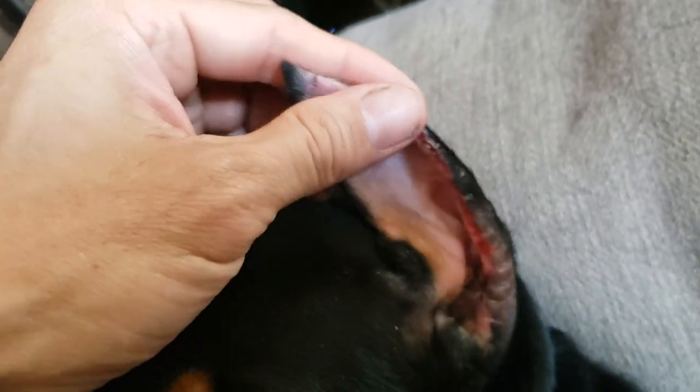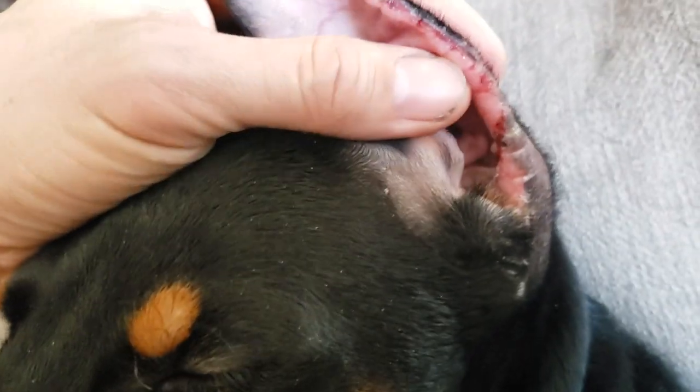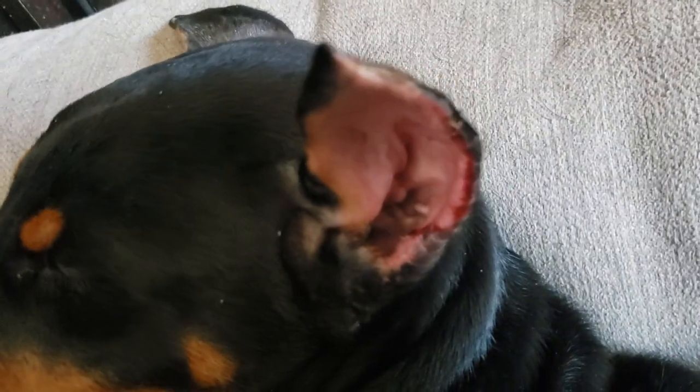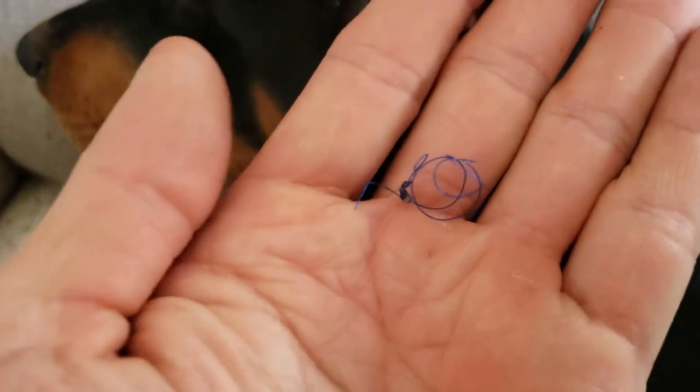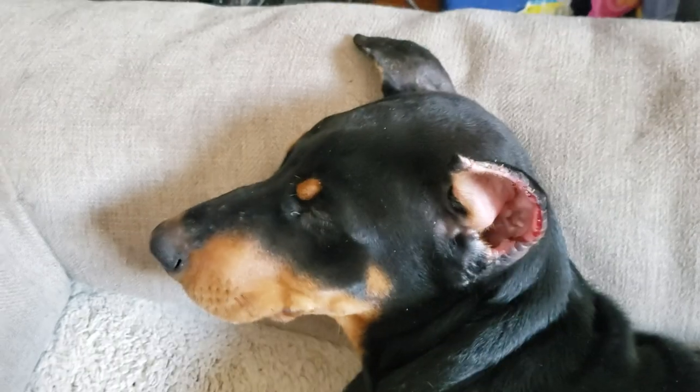I know I have the end, so I know nothing's left behind. I was cutting it shorter as I went along so I wasn't feeding a big line through each single thing. You can double check to make sure there's nothing in there, but I know I got the end and I started at the top, so I know there's nothing in there because it all pulled through. That's probably the biggest thing — making sure nothing's left in, because you can get an abscess. It'll go around the suture material.